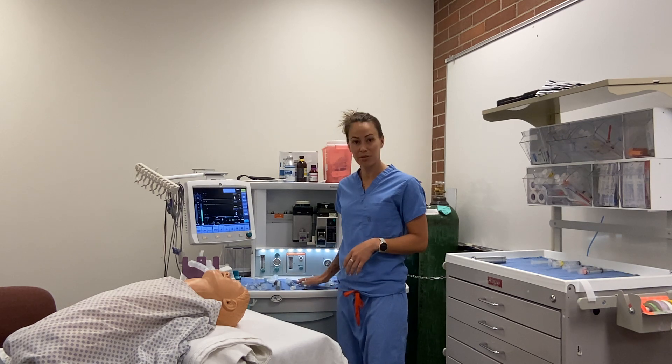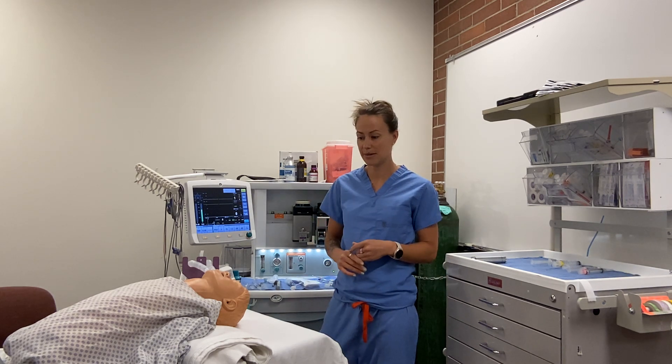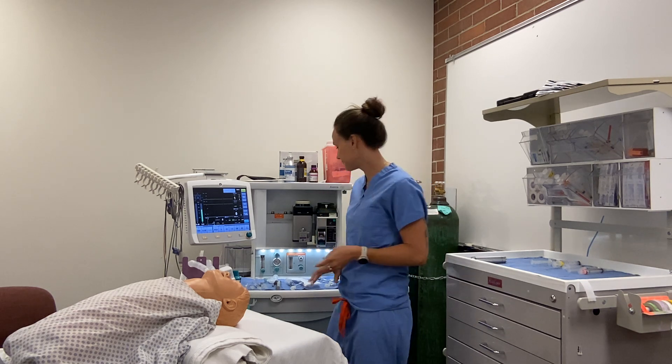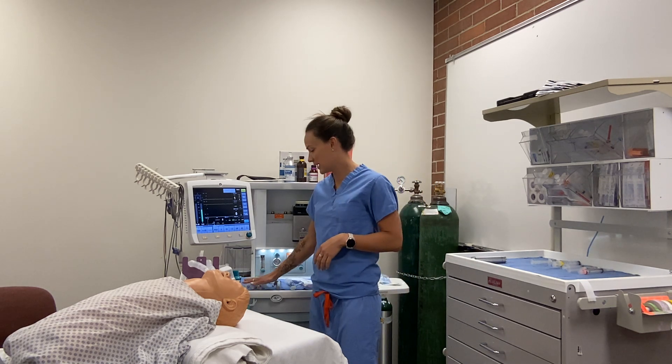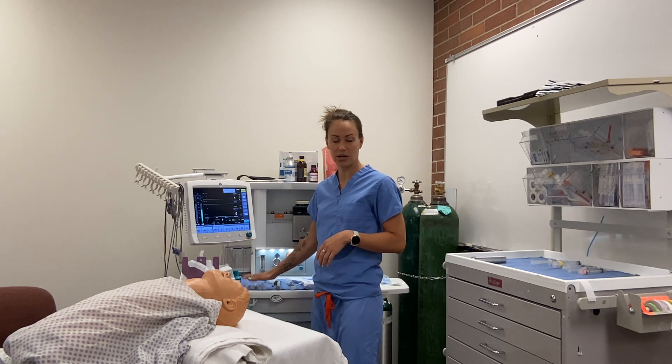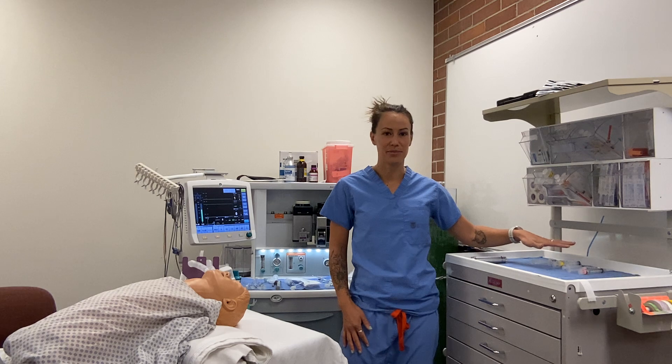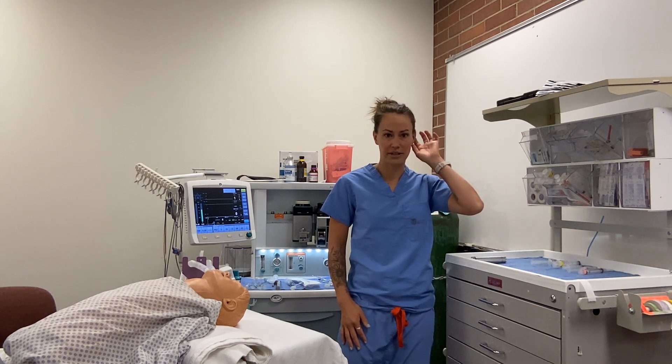For tube depth, we take that 5 and multiply it by 3, so our tube depth for this patient is going to be 15 cm. I also have my IV meds drawn up ready to go and my emergency meds drawn up on my other cart, ready just in case.